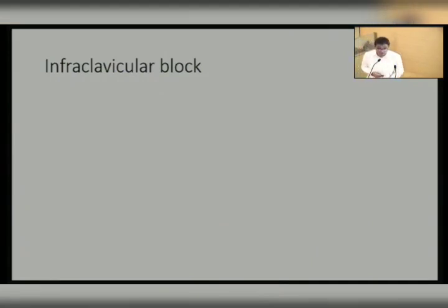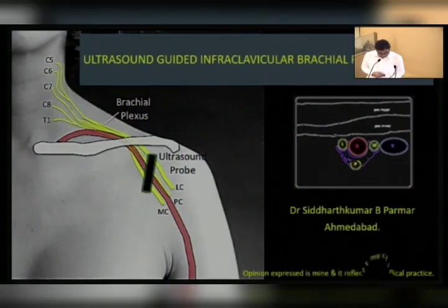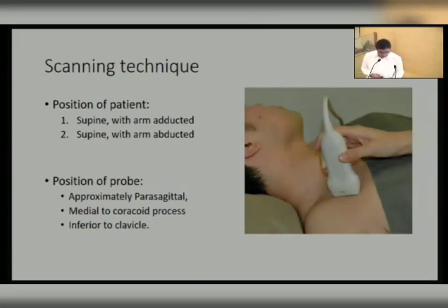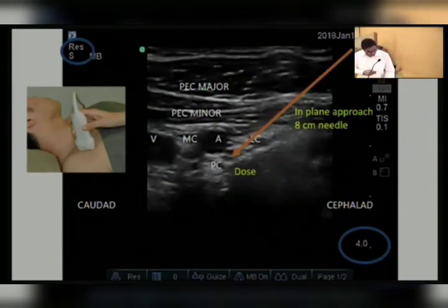So the next block is the infraclavicular block. As we all know, it is a cord level block, and this is the lateral approach of infraclavicular block, in which the cords are targeted: lateral, medial and posterior. For scanning, the patient is supine with the arm abducted 90 degrees with elbow flexion, and the probe that I keep is approximately parasagittal, inferior to the clavicle and medial to the coracoid process. See, just like this. In the usual machine setting, we require a little bit more depth, the needle length will be a little bit higher, and the dose that I use is a little bit higher compared to supine costoclavicular.